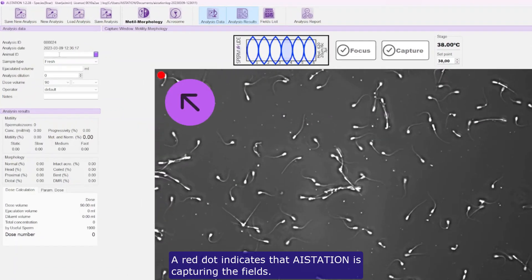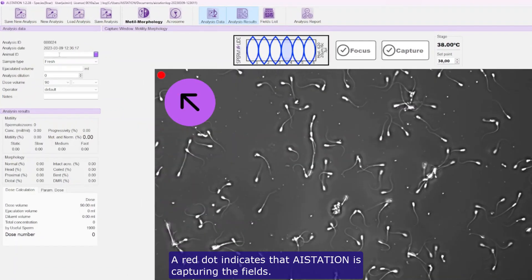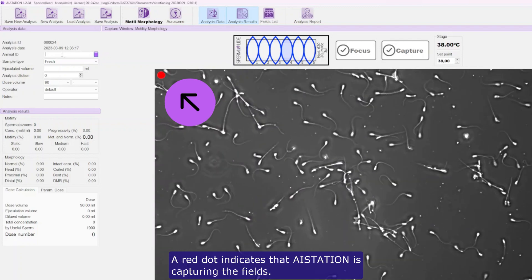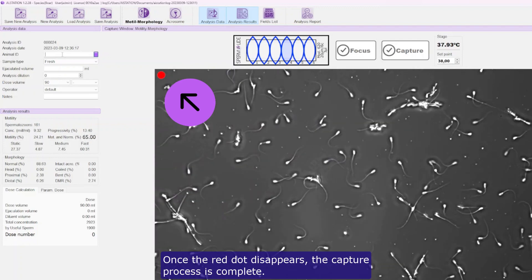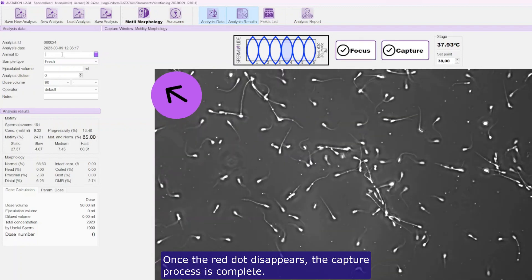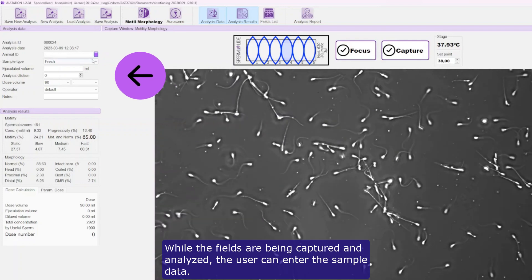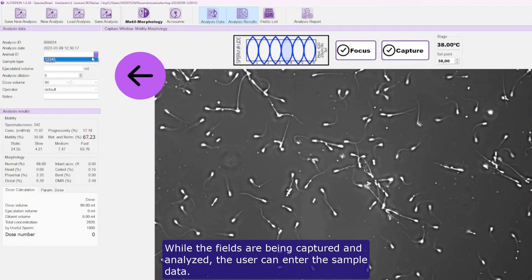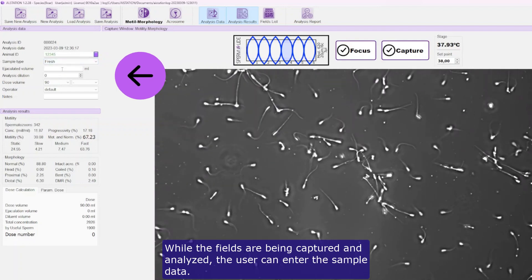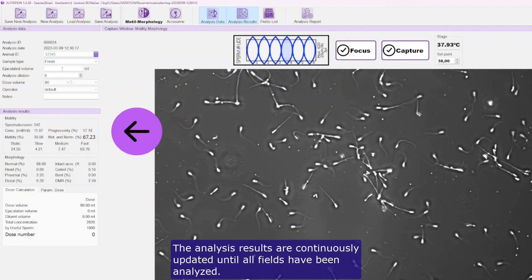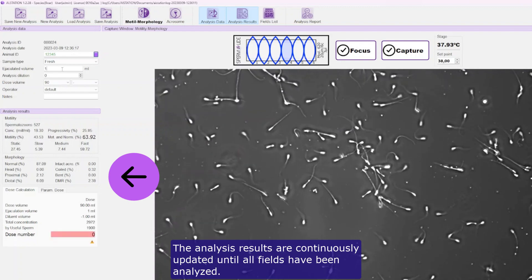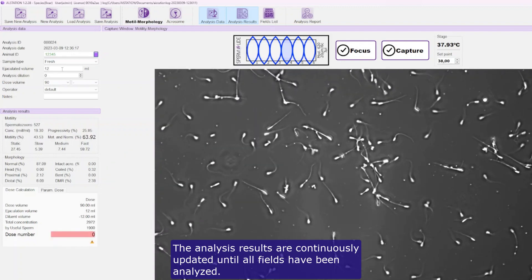A red dot indicates that AStation is capturing the fields. Once the red dot disappears, the capture process is complete. While the fields are being captured and analyzed, the user can enter the sample data. The analysis results are continuously updated until all fields have been analyzed.